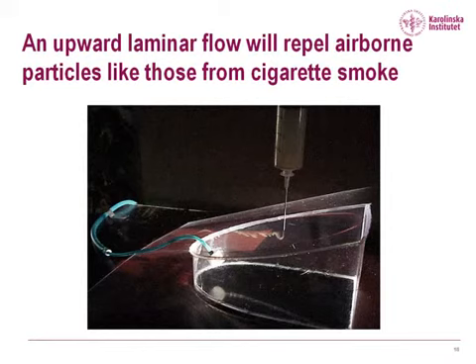And this is an example showing that an upward laminar flow will repel airborne particles like those from cigarette smoke. With this upward laminar flow, all the particles drift away from the cavity.